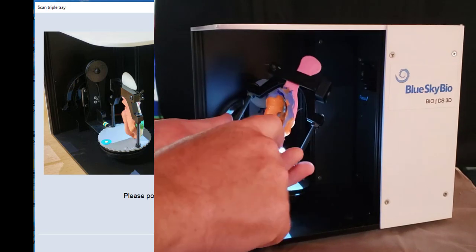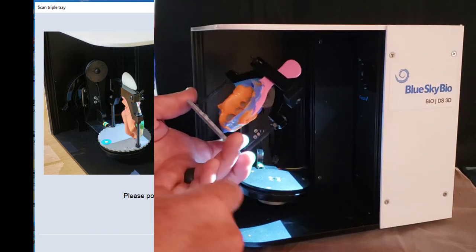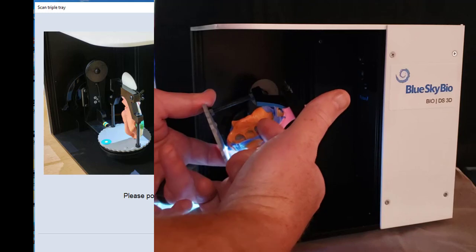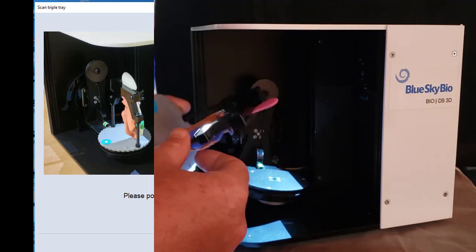You would like to have this where the impression is slightly suspended off of the tray. If you have any excessive deep vestibular sides to this, you can take a Bard Parker knife and just cut off some of that depth so that the camera can look into the impression a little bit better.